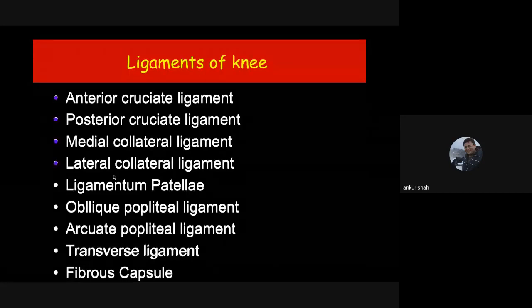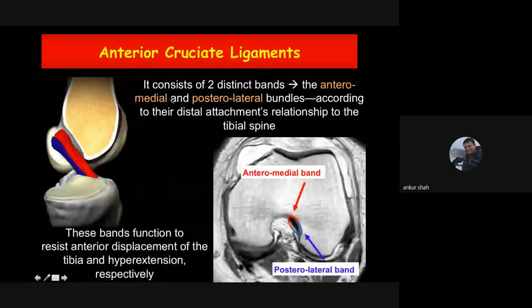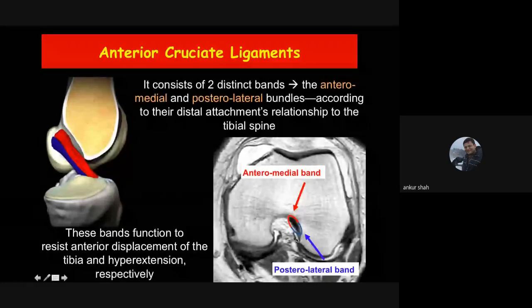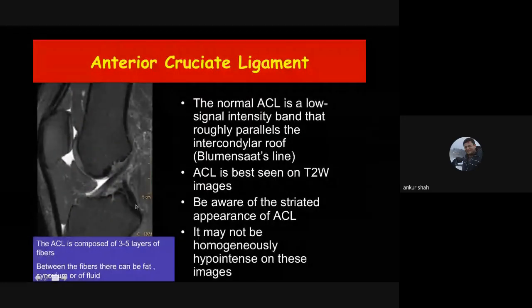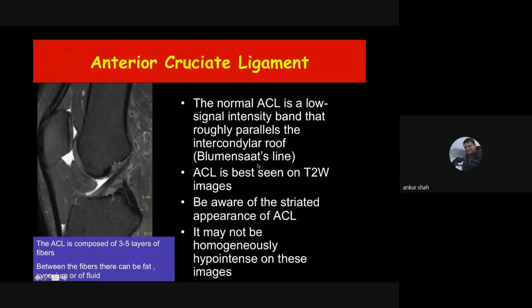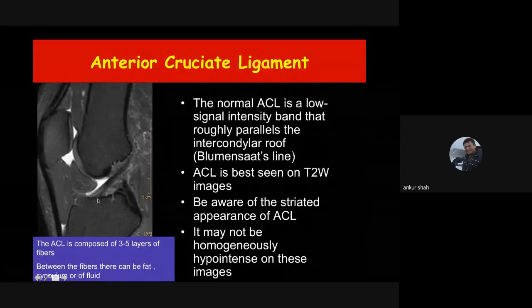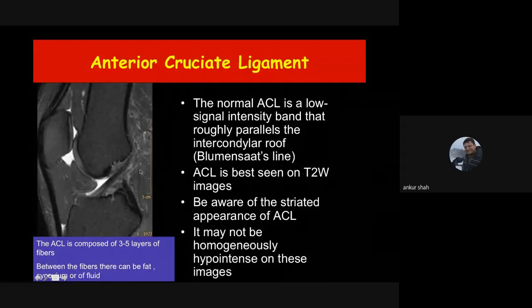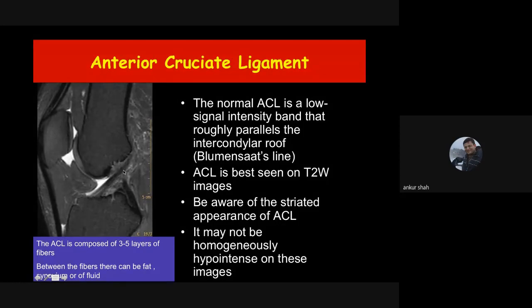After the meniscus, coming to the ligaments: the most important are the two cruciate ligaments and the two collateral ligaments. The anterior cruciate ligament consists of two bands — the anteromedial band and the posterolateral band. Because of these two bands and multiple layers of fibers (three to five layers), the ACL does not have homogeneous hypointense signal throughout and looks somewhat heterogeneous. More importantly, its orientation should be parallel to the intercondylar roof line (Blumensaat's line), but it can have some heterogeneous appearance that is physiological, not a tear.